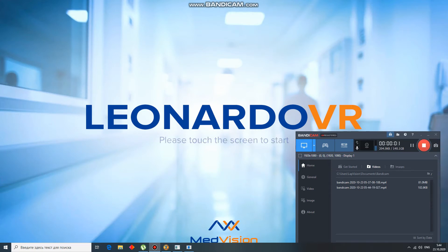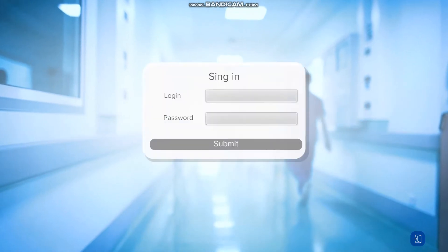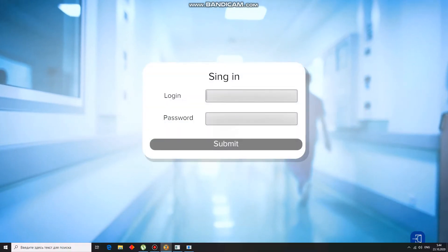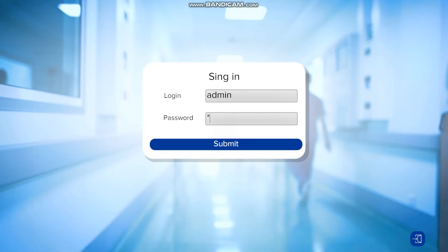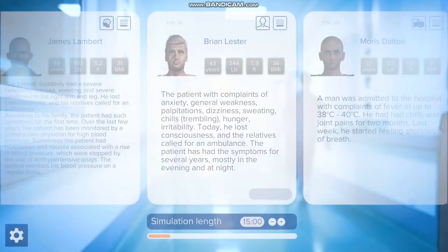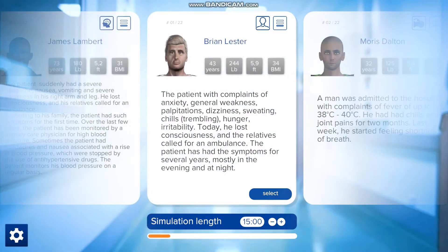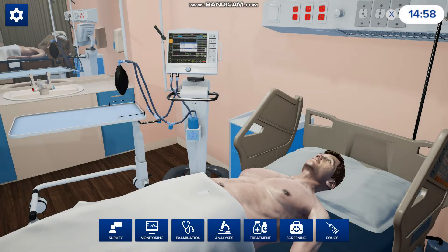Today I'm going to be showing you Leonardo VR. The first thing you want to do is sign in and then press submit. It's going to bring you to the screen where you can choose from 22 different scenarios. Once you find a scenario you want, you press select. We'll use Brian, and then it's going to bring you into the simulation room.